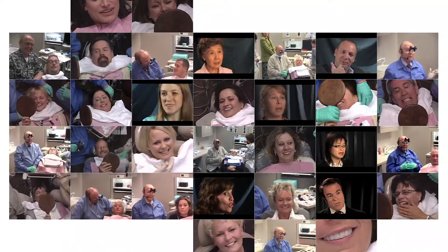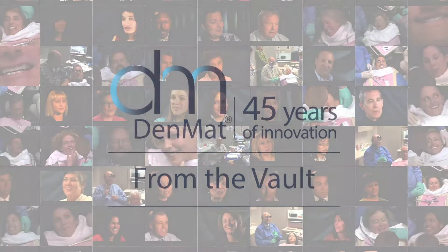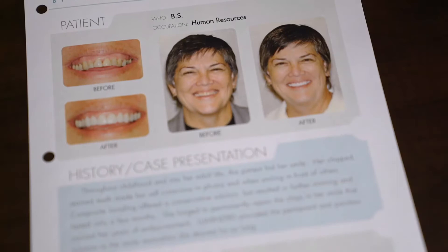We're not treating teeth anymore. We're treating smiles. Isn't that beautiful? Let's look at the transformation from where we started and where we are. Our patient today is an example of that.